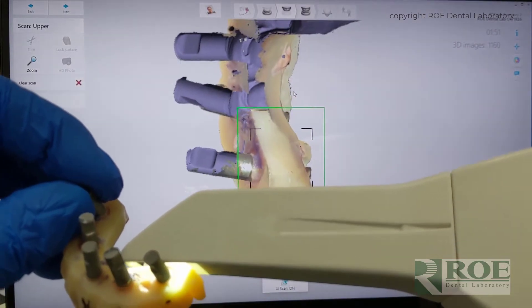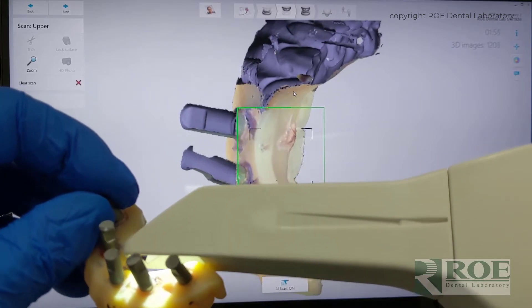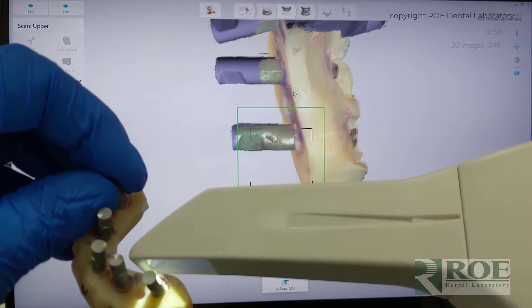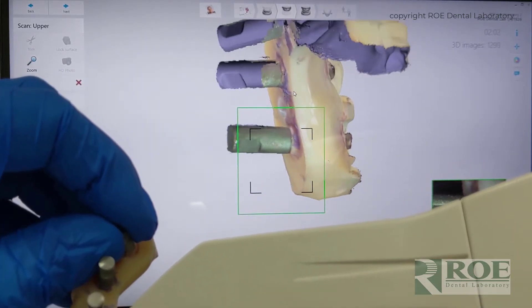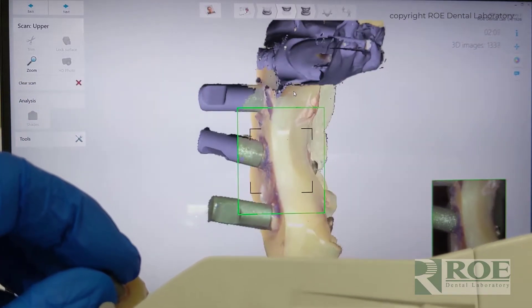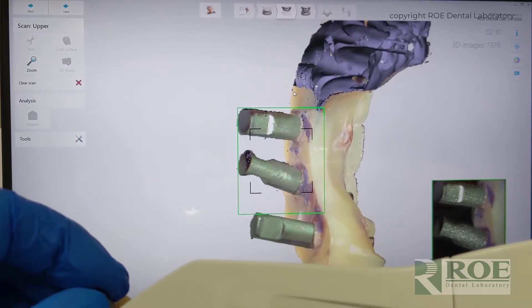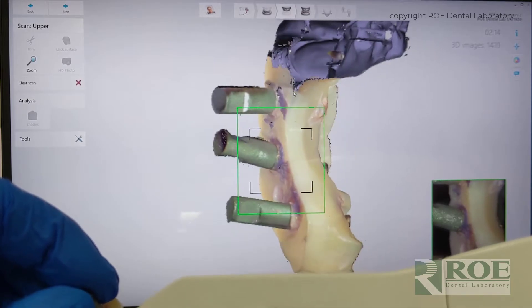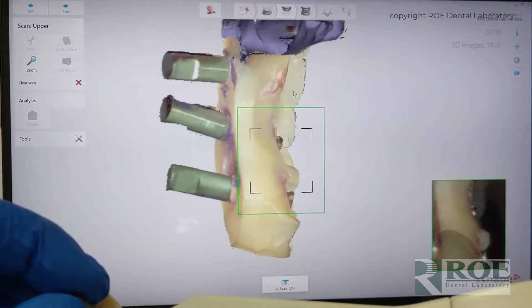Try to keep this in your field of view so you can see both going on at the same time. I'm going to come back around and grab the lingual of this one, and the apical part of it. I'm going to try to grab both of these at the same time because they are on different planes — they don't look the same because they're in different rotations, which is another little trick of setting them up in the first place. Those are good.